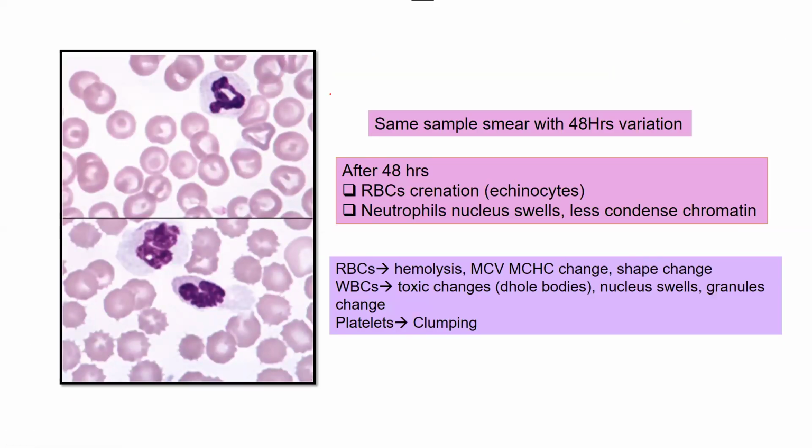These are two different tests. One panel is a biochemistry panel, and the other is hematology. You will fully understand their difference when we start the series after this lecture. The next series is on the biochemistry panel, and after that we will, inshallah, do the series on hematology, so you will see the difference. But this is something related specifically to hematology, that you see in these two pictures.